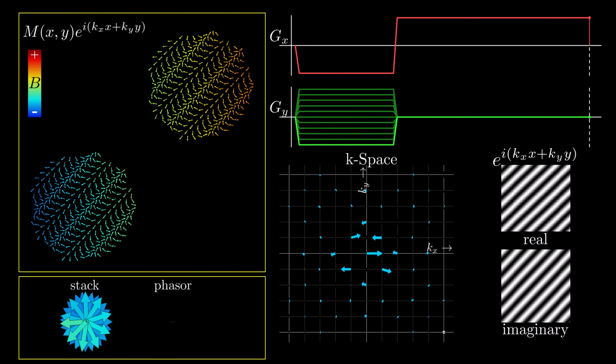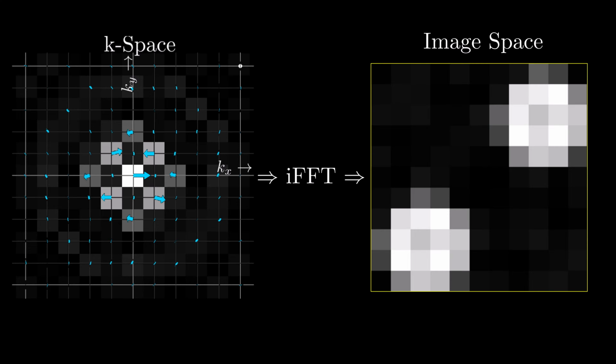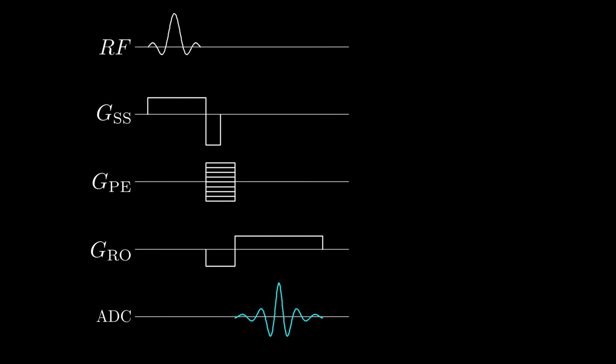Now, in the process of animating this slide, I populate k-space with the actual calculated vector sum of my spin map. So if everything I've said is true, we should expect that if I inverse Fourier transform this k-space data, I should get back my image. Well, I went ahead and did that, and look, a reconstructed image of our two phantoms. It's of course as equally low resolution as our k-space simulation, but I thought that was pretty cool, and an important verification that I coded my animations correctly. So there you have it, friends, that is the gradient echo MRI pulse sequence.